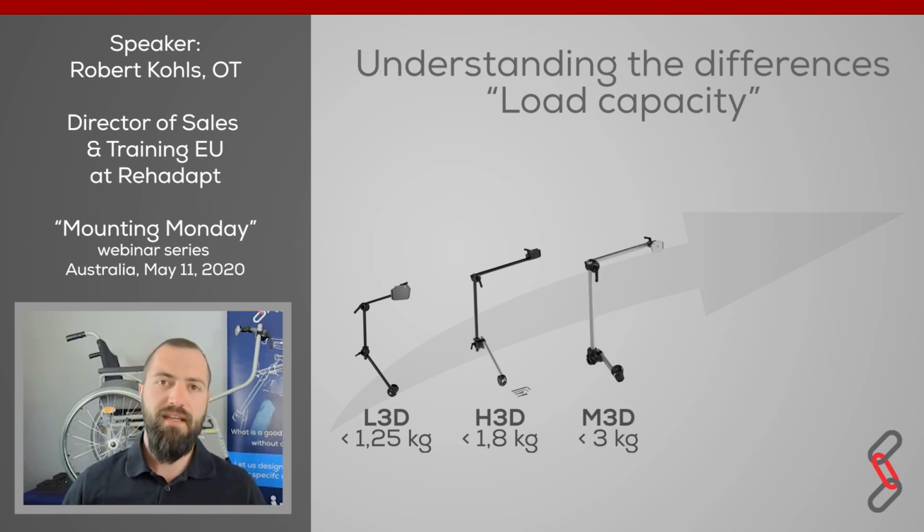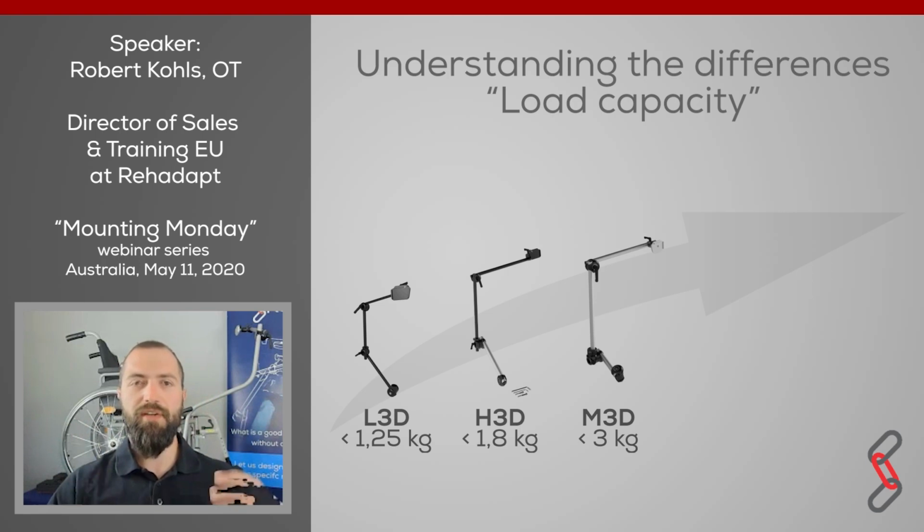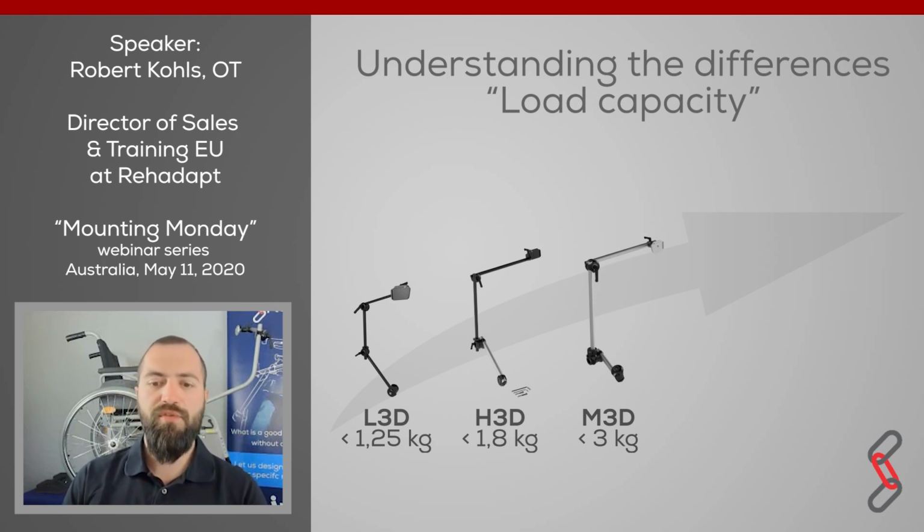Also, when the device is getting a little bit heavier, like the Grid Pads, the XZ1400 with an eye tracker, or the Tobii devices, then the M3D mounting solutions are going into the direction for devices up to 3 kilograms total weight.